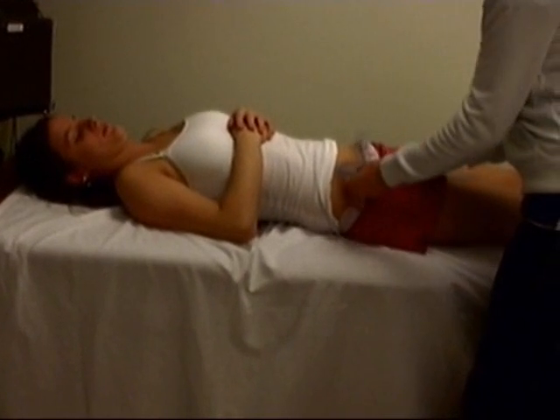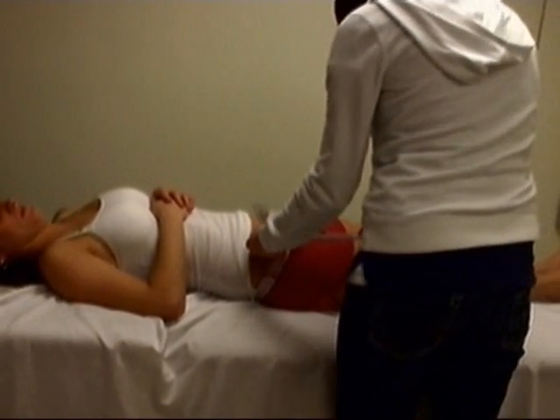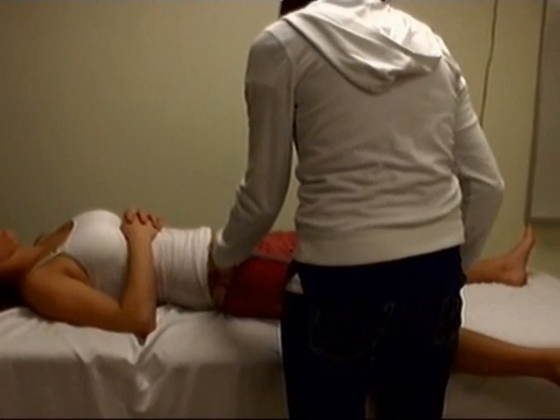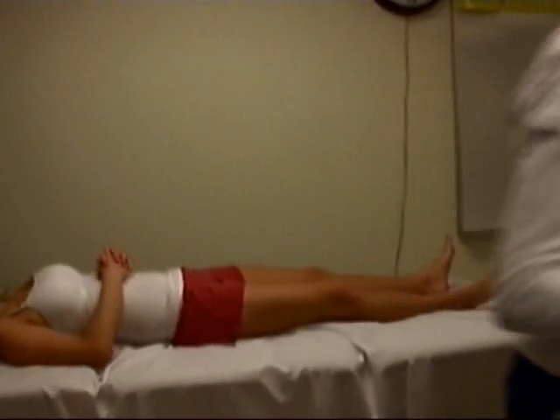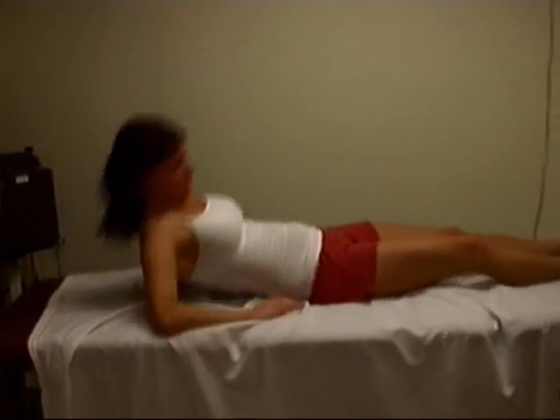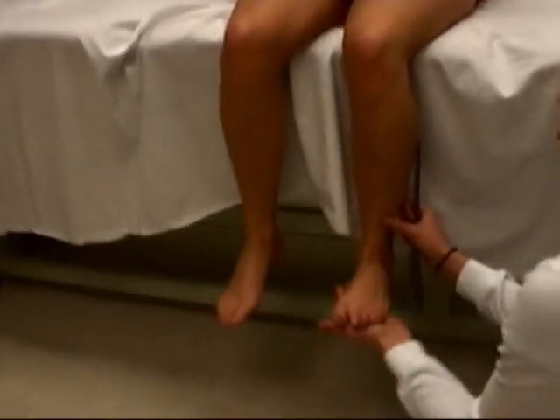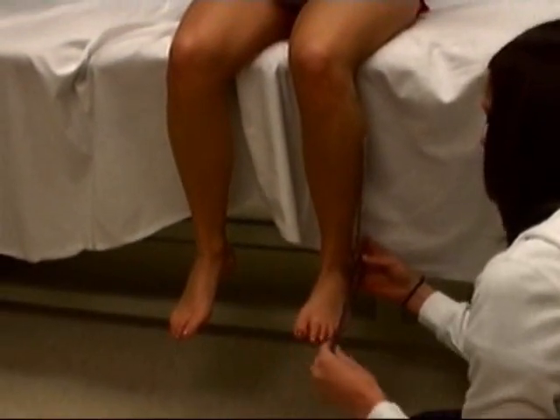Hip abduction — we're going to do this. We're going to start from one ASIS to the other, the mid-leg, the other to the top. So I'm going to take your lateral malleolus, start to neutral, and you're going to be in parallel to your fifth metatarsal.